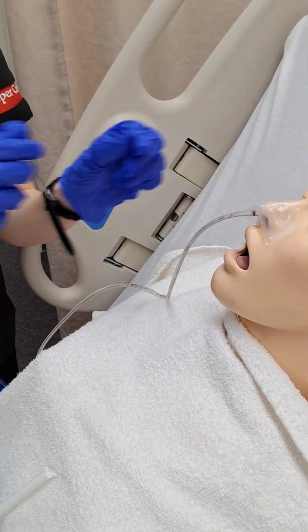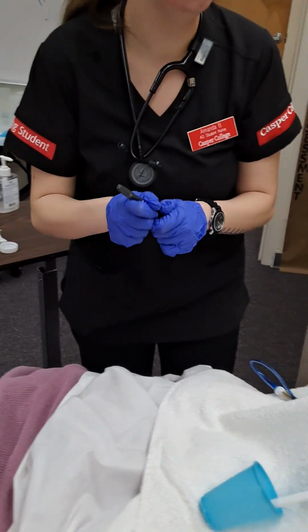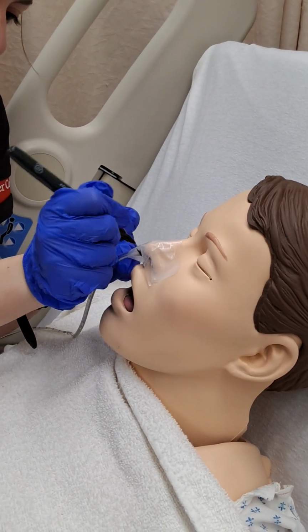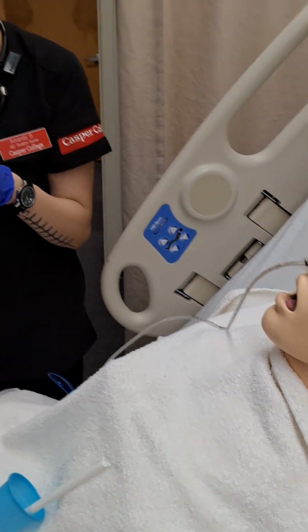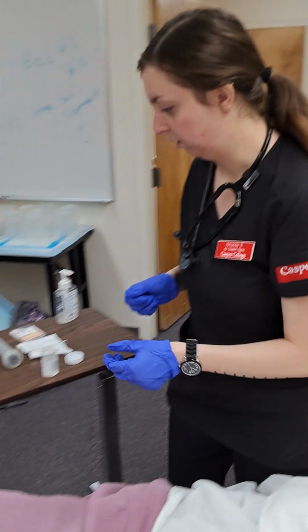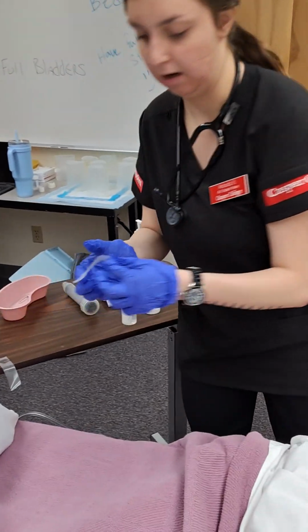Now I will mark it again. Throw this away since I used it on him. And now I'm going to pin it to his gown.